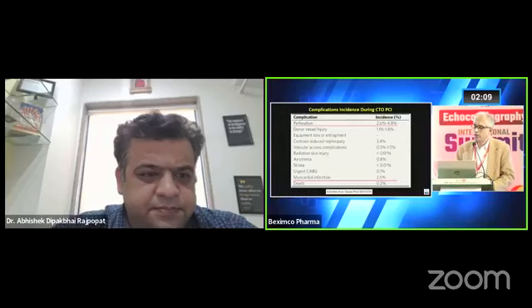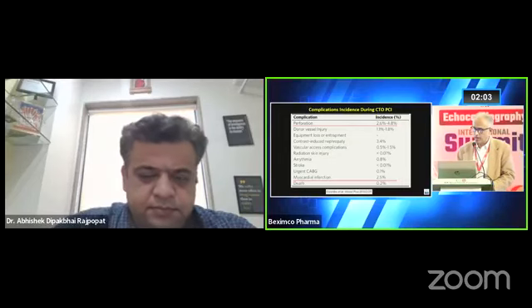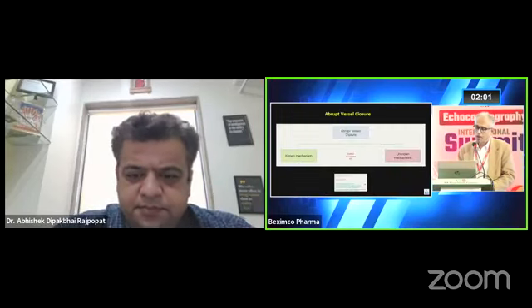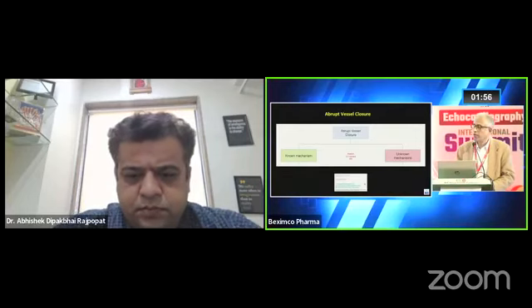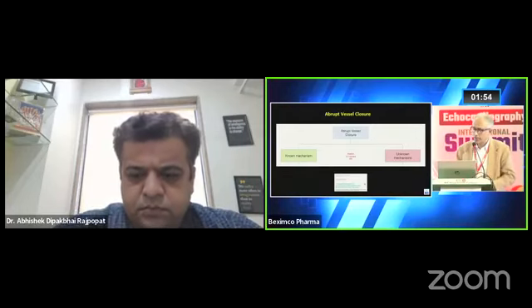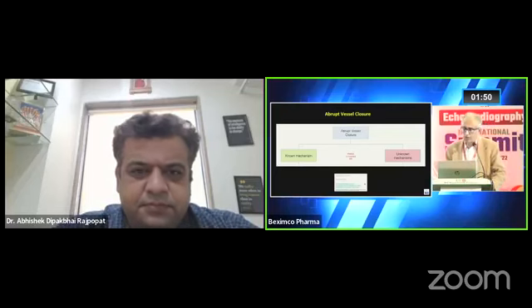Anywhere less than 5%. Myocardial infarction can happen. So these are the two big ones which one can try and find out in terms of echo. Abrupt vessel closure. So again, looking at the RWMA, whether it is improved, worsened, more segments involved, LV function, looking at MR. So this is where sudden closure occurs.